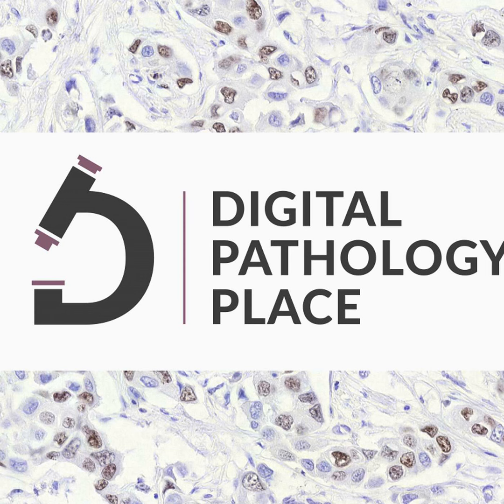They also used a technique called image appearance migration, a technique that substantially improves cross-institutional model generalizability. So what is this IAM, image appearance migration? It is basically data augmentation, making these images for training and manipulating them so that the model is more generalizable. It can also include GANs, generative adversarial networks, and different AI techniques to make the algorithm more general.